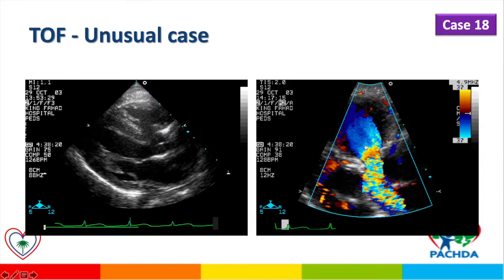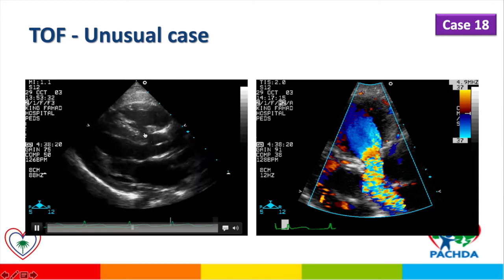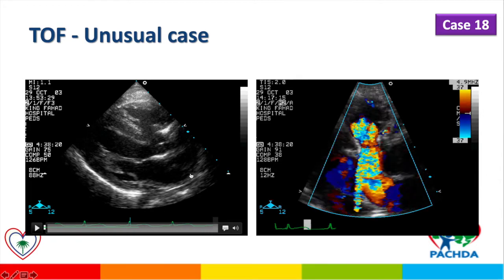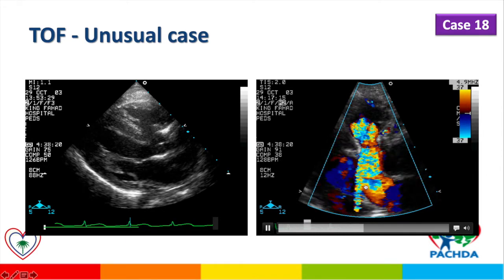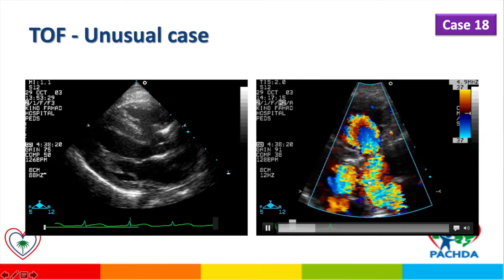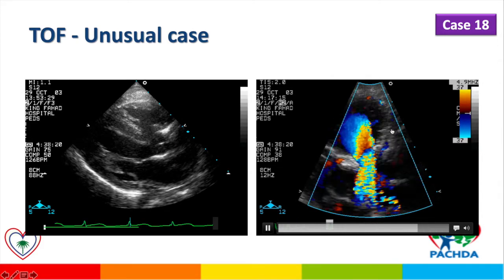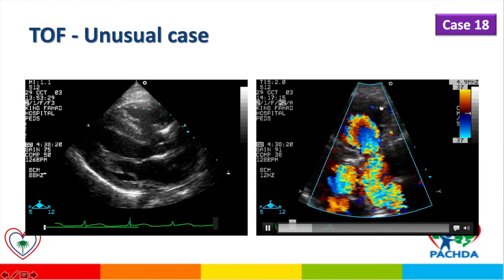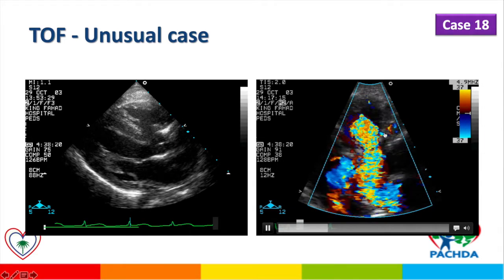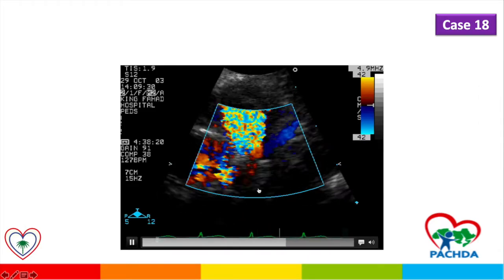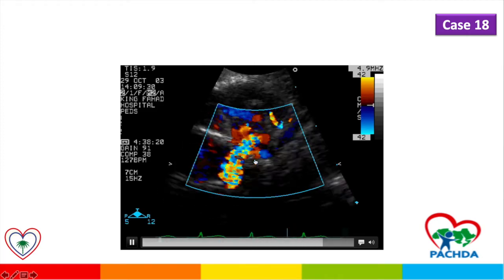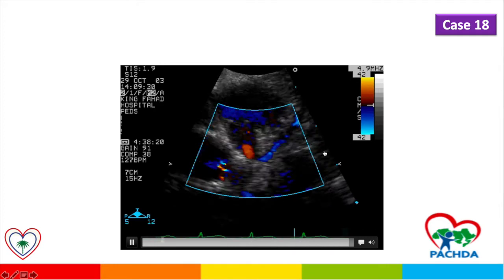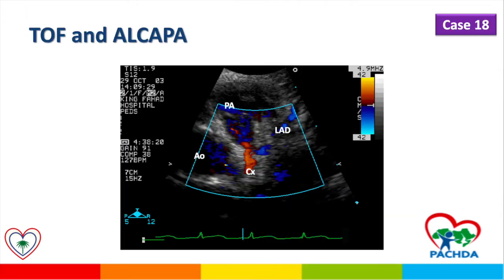This is an unusual case of tetralogy of Fallot. The patient has a large VSD with overriding of the aorta and all features of tetralogy of Fallot, with severe valvular and subvalvular right ventricular outflow tract stenosis. We noticed significant signal on the right ventricular outflow tract, raising concern for coronary artery abnormalities. On careful inspection, we can see the left coronary artery coming out of the pulmonary artery with a reversed flow pattern — so this patient has ALCAPA in addition to tetralogy of Fallot, which is a very rare combination.